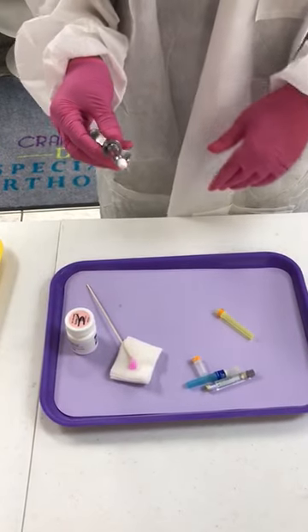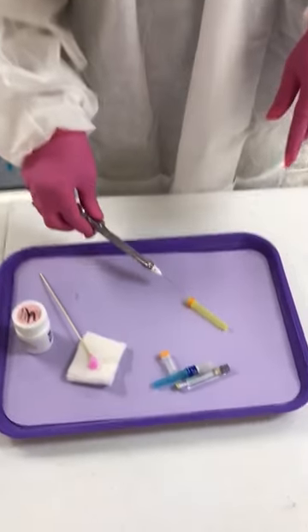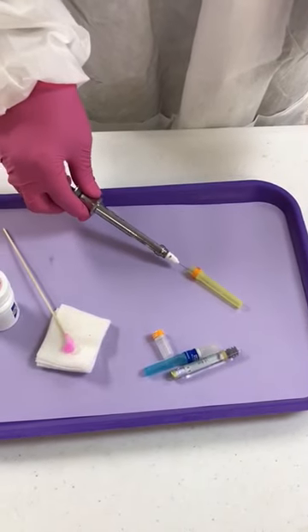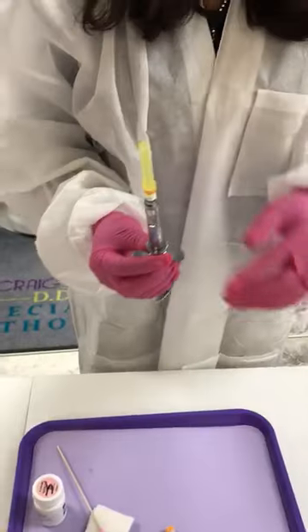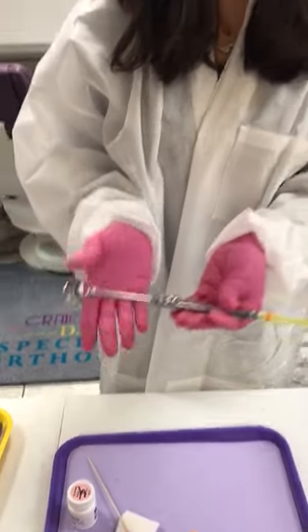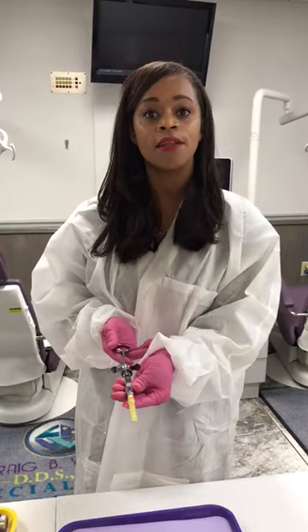So you have to make sure you take care of yourself and protect yourself. What we're going to do is one-hand cap it — see that — then we push it up. And that is a tutorial on how to set up an anesthetic syringe.